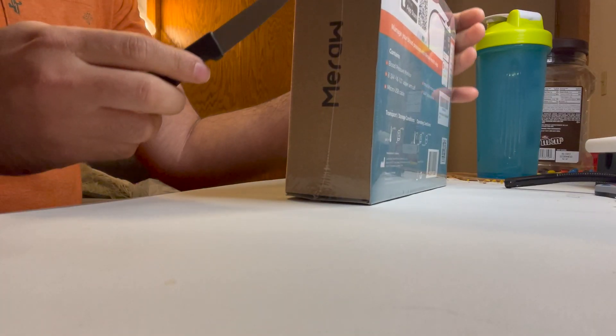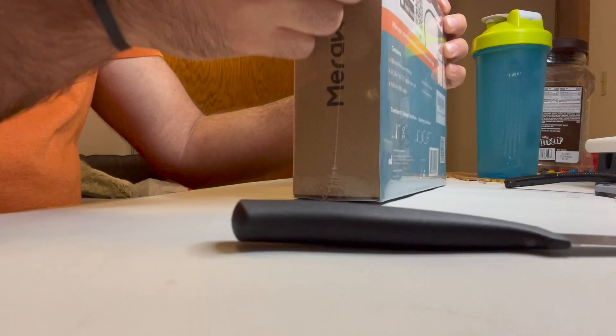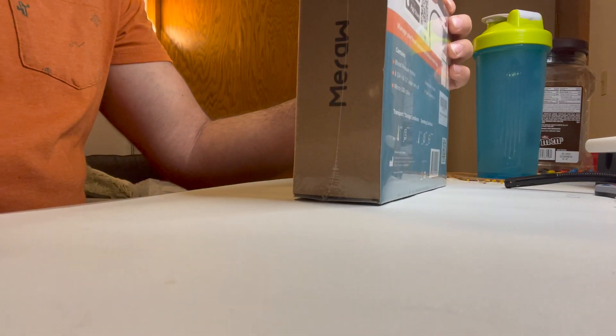The cool thing about this one is that it is Bluetooth and, like I said, boxed really nicely. I'll go ahead and unbox the plastic wrap right off the bat here.